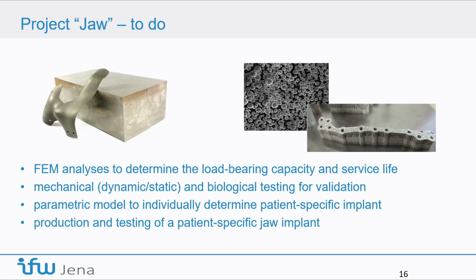So the first thing was an FEA analysis about load bearing. If you have a jaw, you have high bending loads, and this was done in a model, and also to predict service life, to verify the model. Mechanical testing was done, dynamic and static, at IFW, as well as biological testing for validation. Out of this result, a model to calculate for each patient a special implant, also regarding the lifetime, and then a patient-specific jaw implant, all was validated.